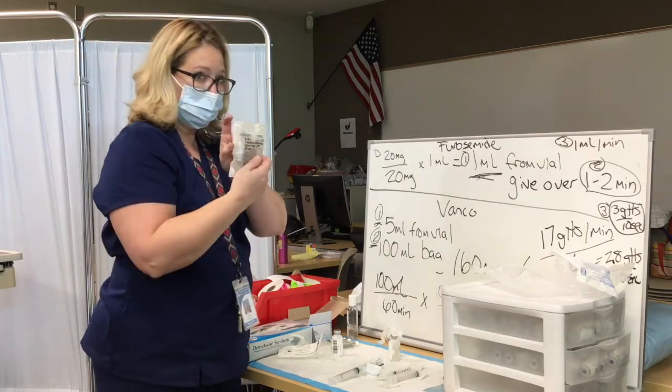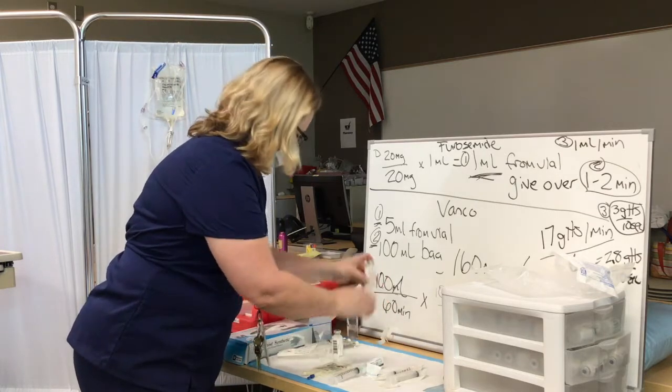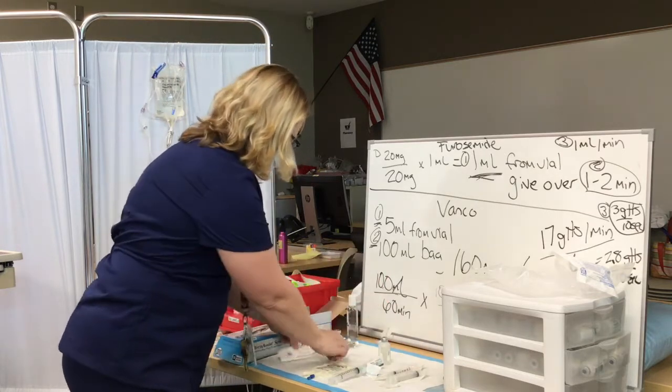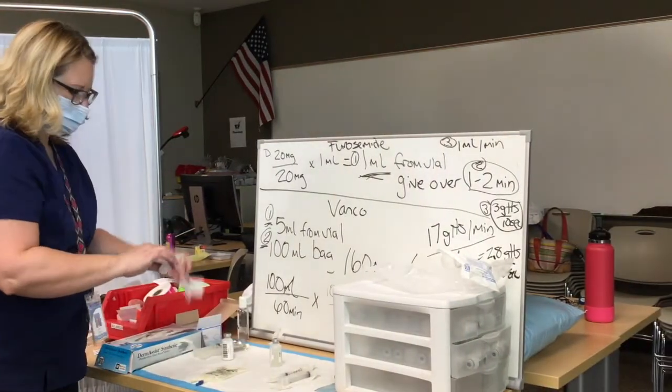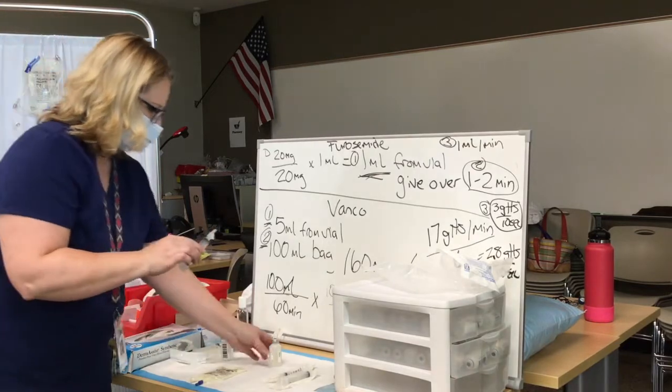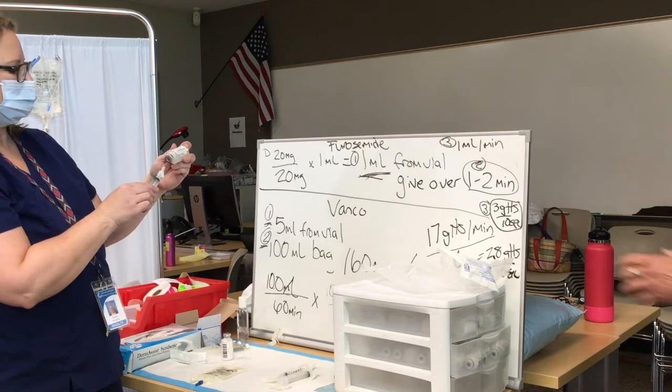And we have a 100 milliliter bag. I know it's 100 milliliters. And we've cleaned that off. I'll let it dry. And we're going to pull back in our vancomycin, 1 gram, 10 milliliters.